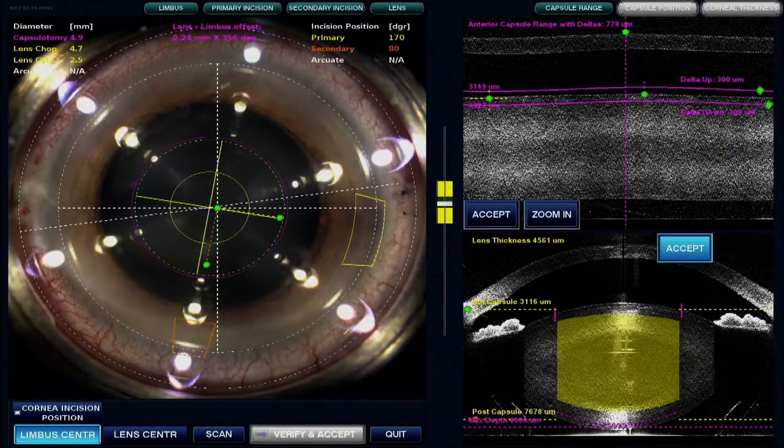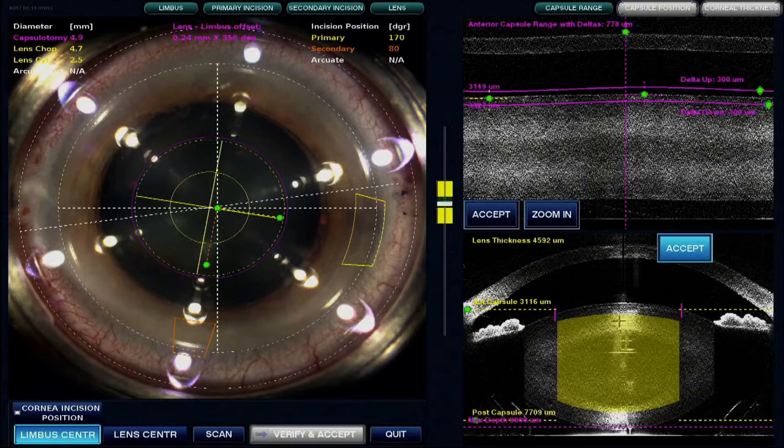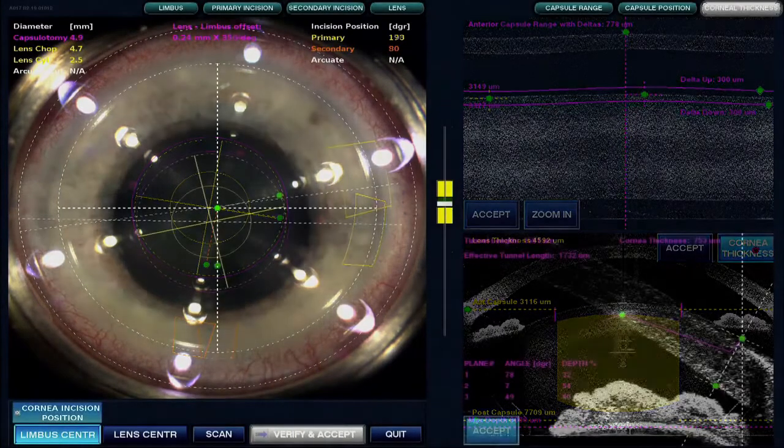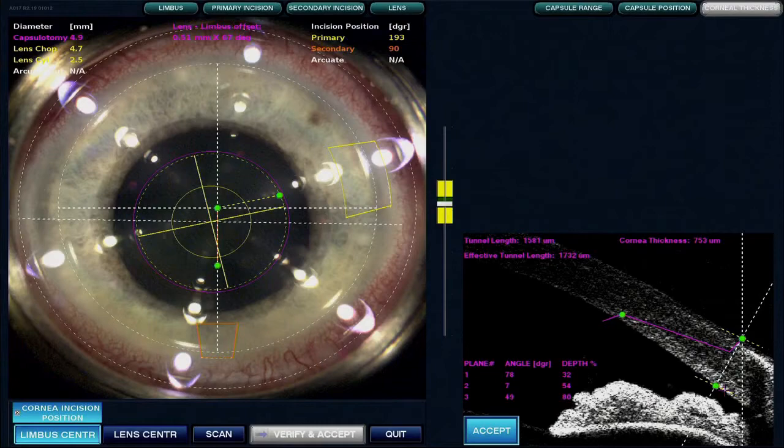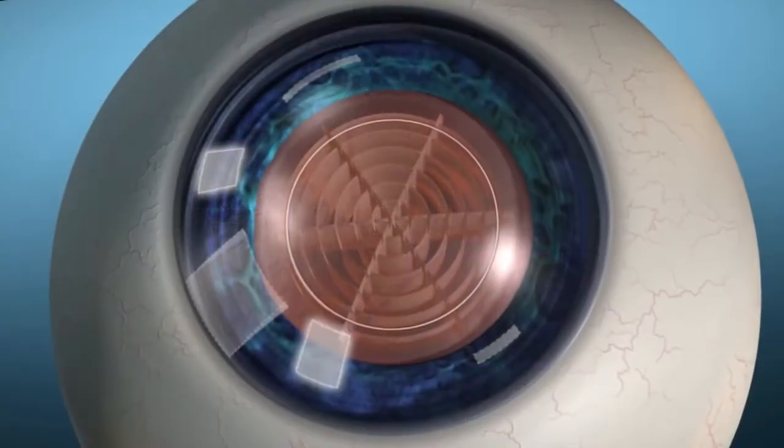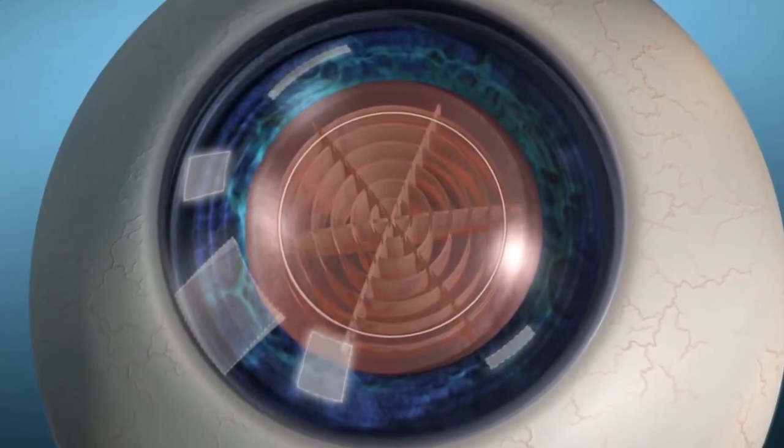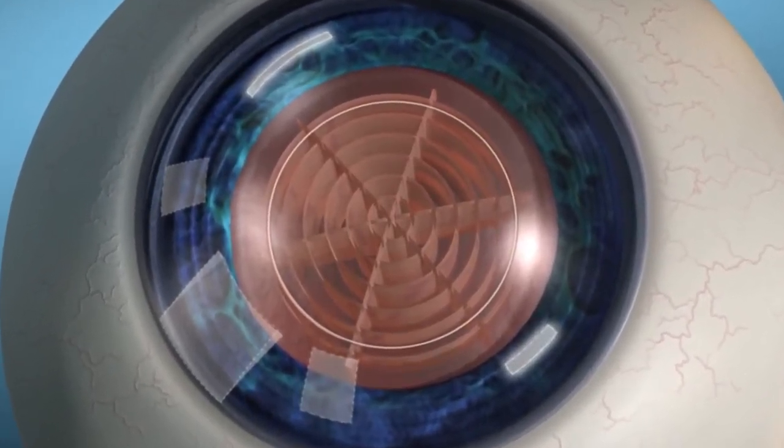The large-range OCT rapidly scans the entire anterior segment. This allows each step of the procedure to be easily planned, customized, and executed. The software now includes bimanual incisions and independent arcuate incisions for further surgical customization.